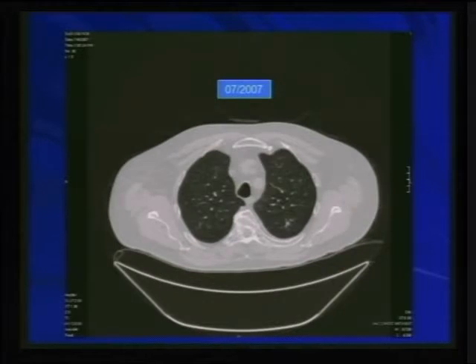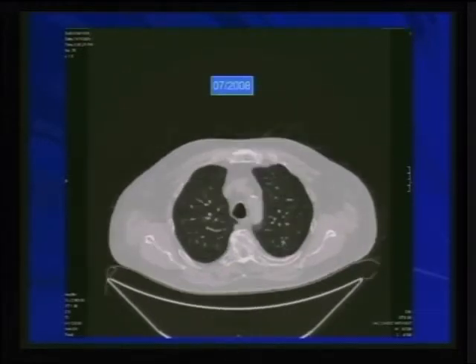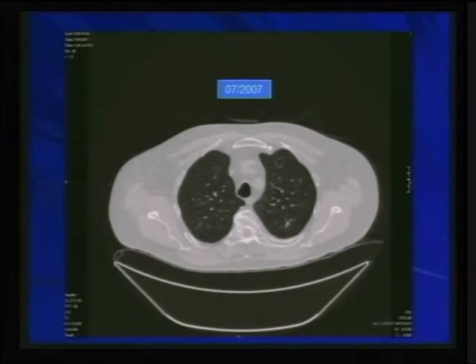This is a patient in 2008. You can see this tiny nodule in the posterior aspect of the left apex here in 2008. However, the person that compared it to 2007 thought that actually the lesion was bigger in 2007 and said, okay, well, this is something that is most likely benign, and didn't ask for more follow-up.